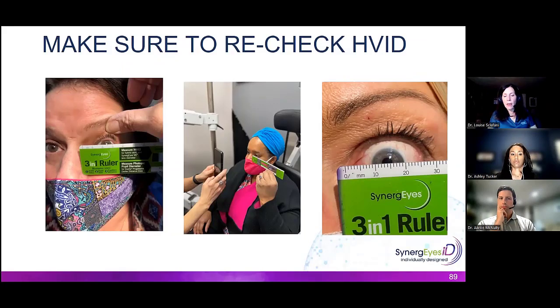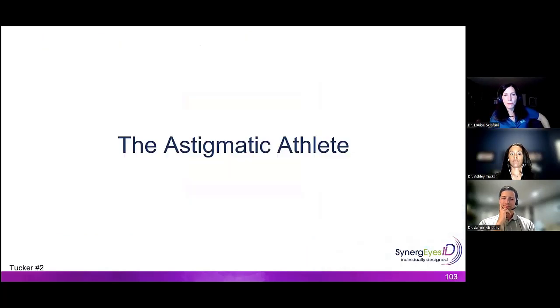And Ashley's going to talk about this in a little bit, but the image on the right is something that one of our wonderful consultants came up with. And that is, rather than taking time and getting nervous and shaking your ruler when you're measuring it, just take a picture of it and sit back and then take the measurement. So I'm going to let Ashley now talk about some patients that you might not think about putting a hybrid lens in, and that's kids.